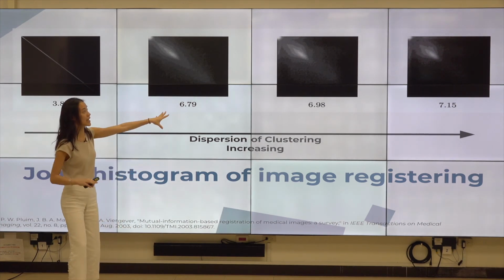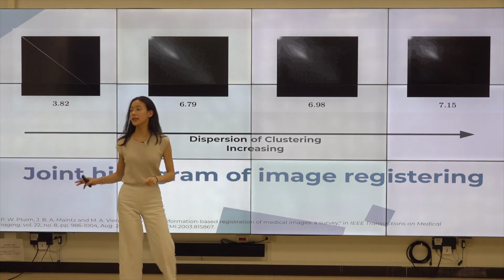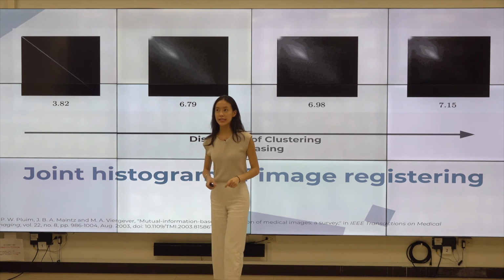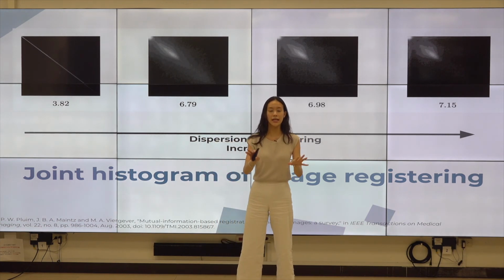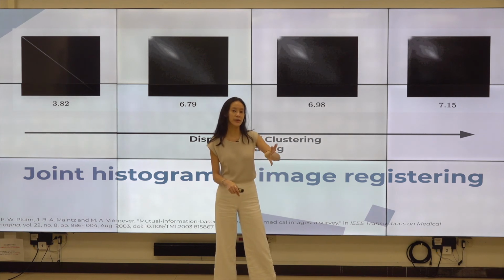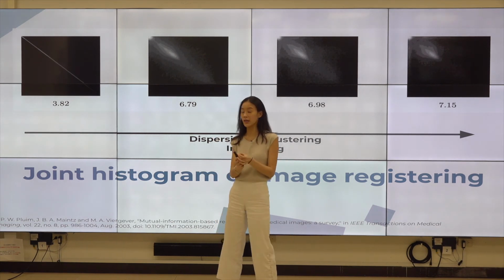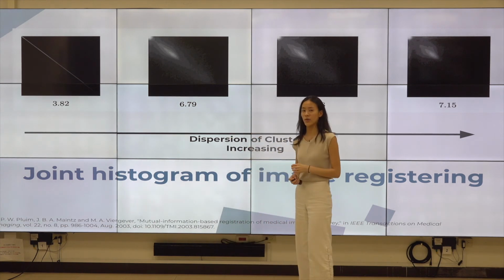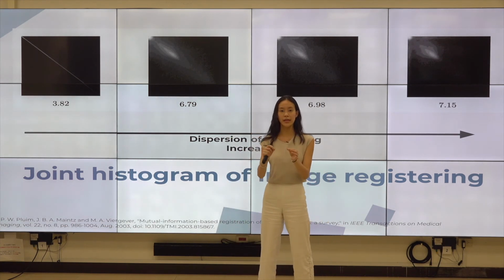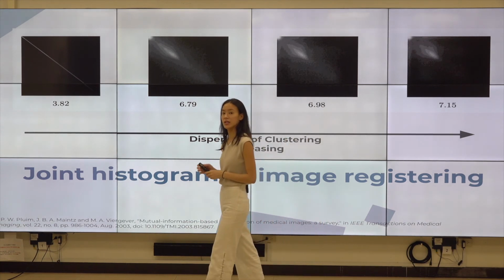Whereas in this aligned situation, we can see the two colors, blue and yellow, adding up together. In this situation, you would still see a little bit of blue and a little bit of yellow on the sides if we have the two circles coming together. However, in this aligned situation, you can see the blue and yellow circle completely on top of each other, creating that green color.